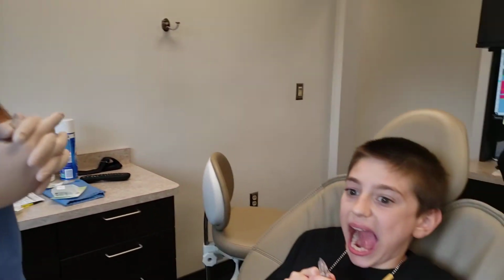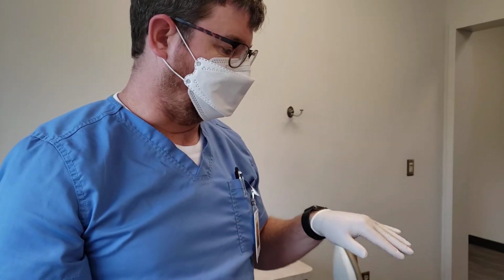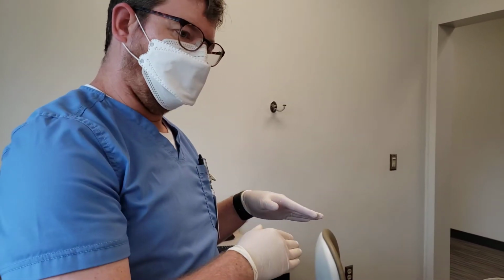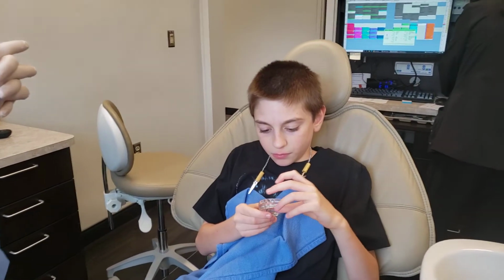Awesome. So what I want him to do is wear this for the next 4 weeks. I want him to wear it an hour one part of the day and then an hour later. For some people it's mid-afternoon and then evening.